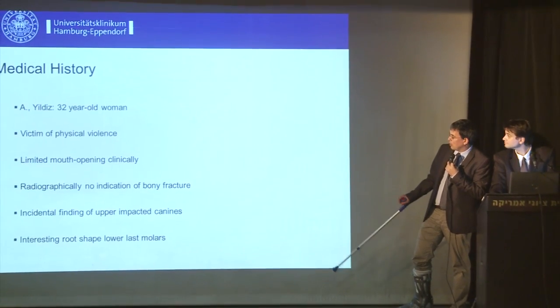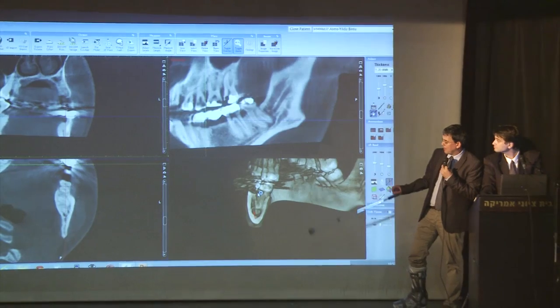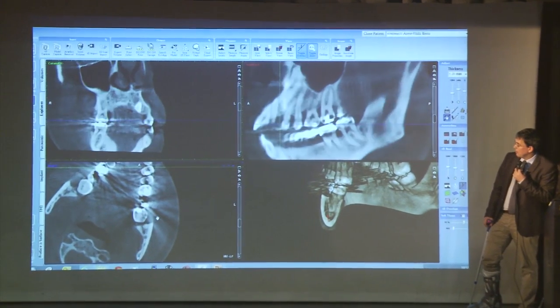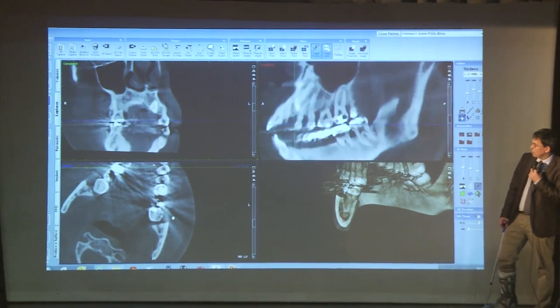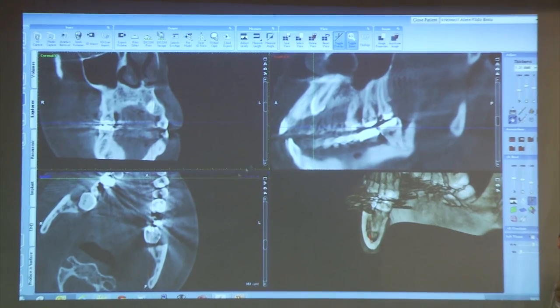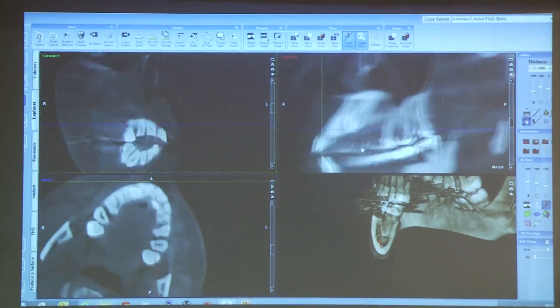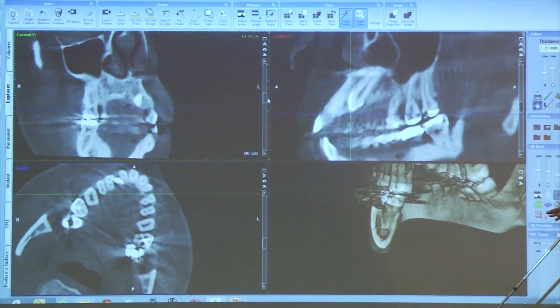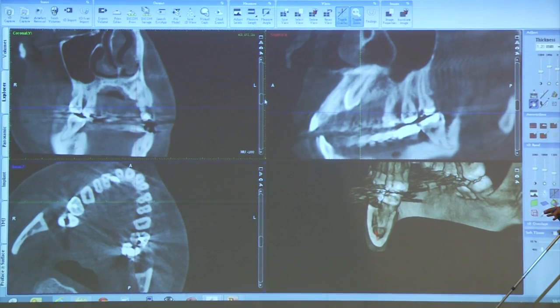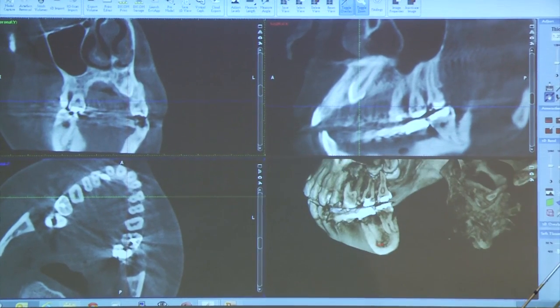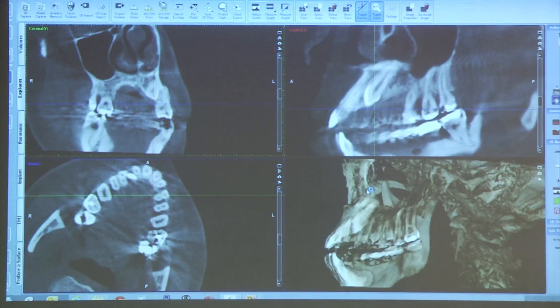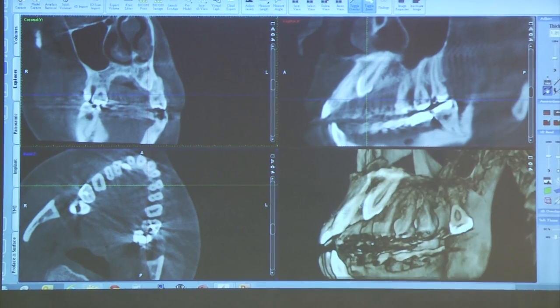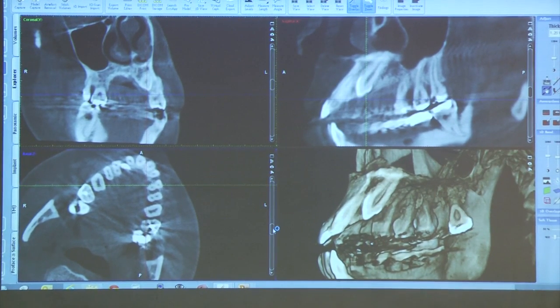In the upper jaw we had some impacted canines. To show quickly that these teeth would ideally be brought into the dental arch with orthodontic treatment — the root shape is very nice, so there is no reason not to start orthodontic treatment after surgical exposure of the canines.